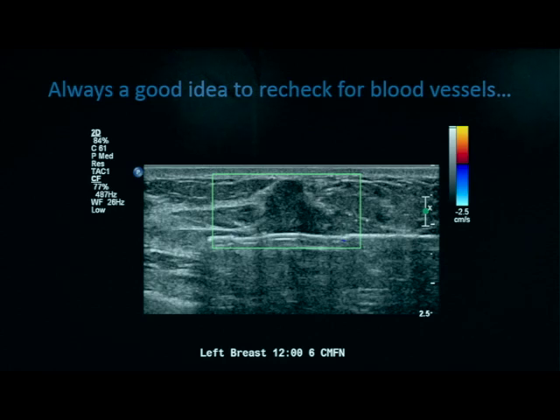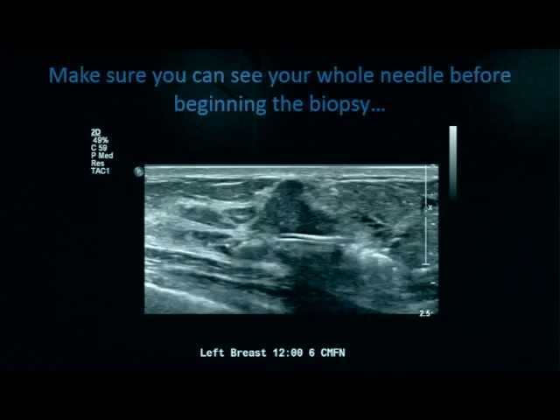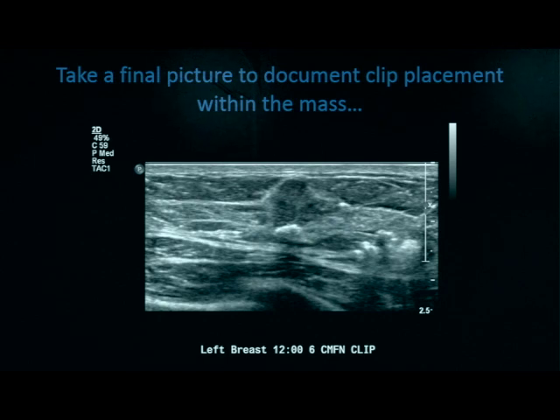Always recheck for blood vessels before you take any tissue. Show the aperture opening with the mass being sampled, and make sure you see your whole needle before beginning any biopsy. When you're satisfied you've obtained enough tissue, it's important to place a fiduciary marker like a clip. The needle tip should be within the lesion itself — not above, not below — but within the lesion that you've biopsied. Slowly draw the needle out while deploying the clip. Here we see a hyperechoic clip within the lesion and the needle tip being withdrawn. Take a final picture to document your clip placement within the mass.